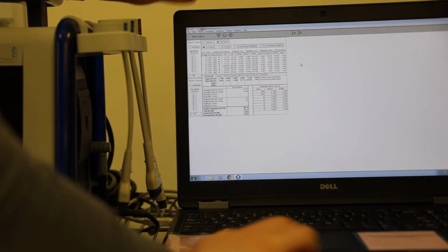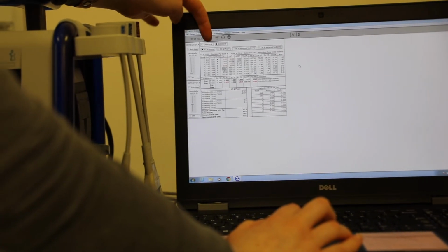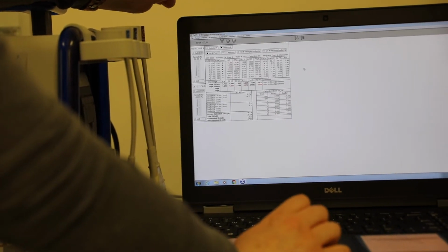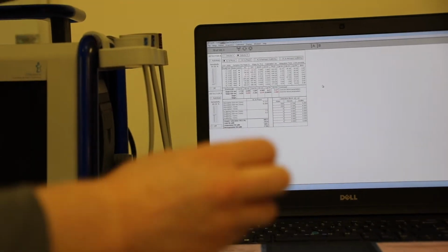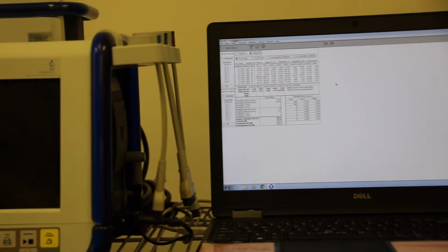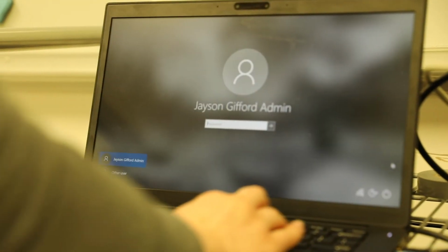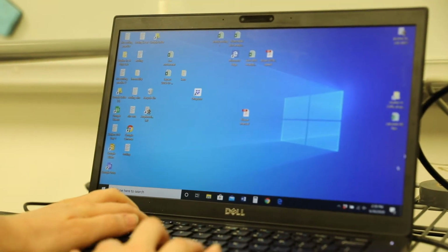Then you don't have to hit start or anything because it's already started when we clicked this top button when we were calibrating. So those two steps are already done. So now it's saved and it's being recorded for that specific subject. So now to measure it and to see the data we're collecting, we're going to come back over to this computer and log in. And the password is just password.